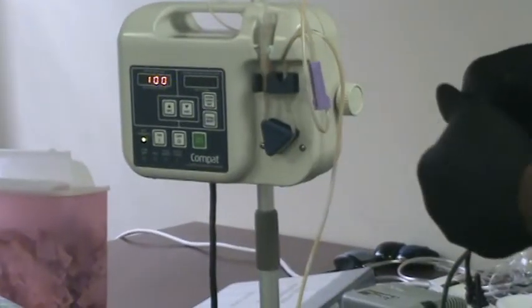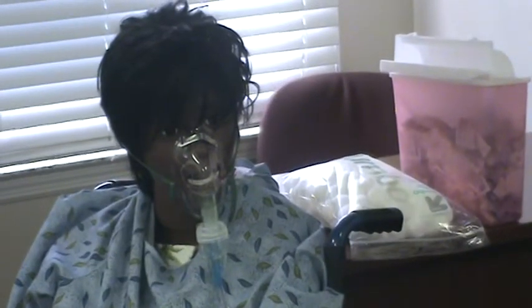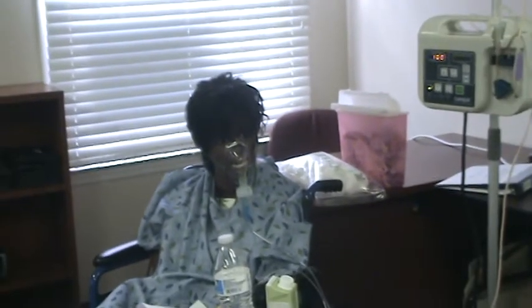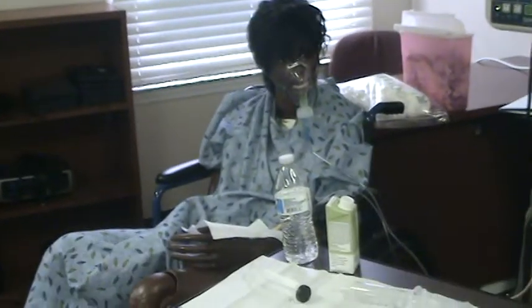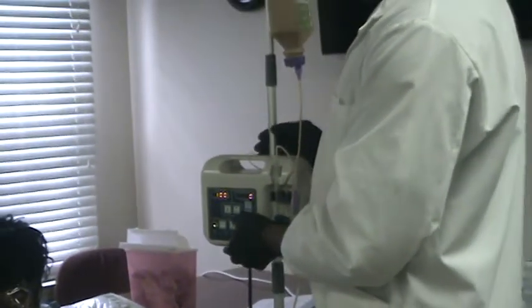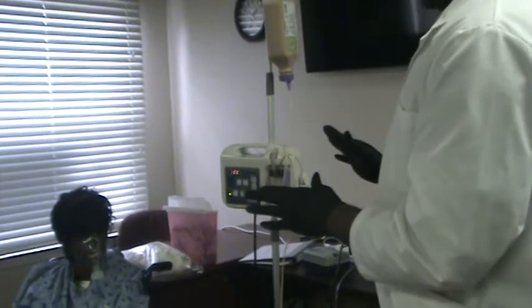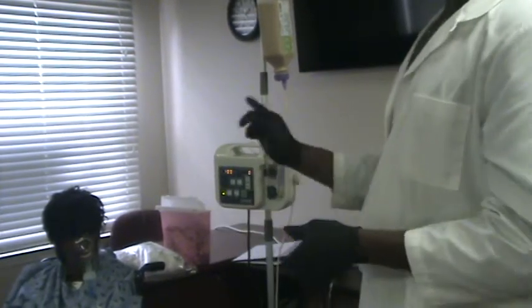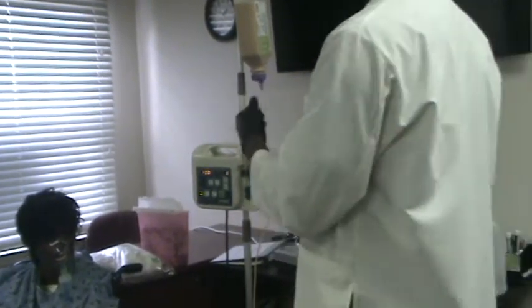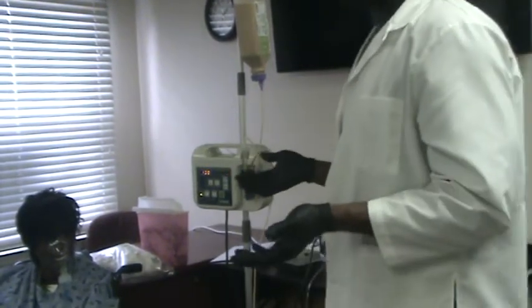So let's assume you want to make sure she's in upright position, whether she's lying in bed, the head of bed needs to come up like 70 to 90 degrees, to avoid aspiration. But let's say you want to do medication or do something while this is running. Because let's say you start the feeding at 4, but at 8 o'clock she needs to get medication.